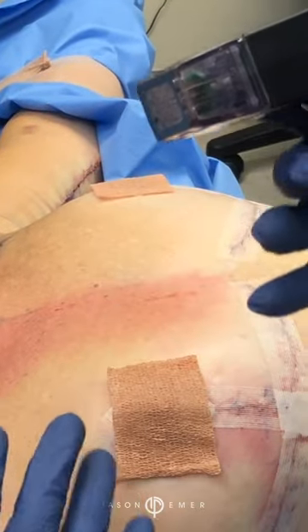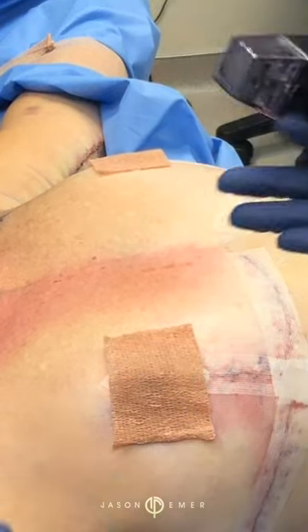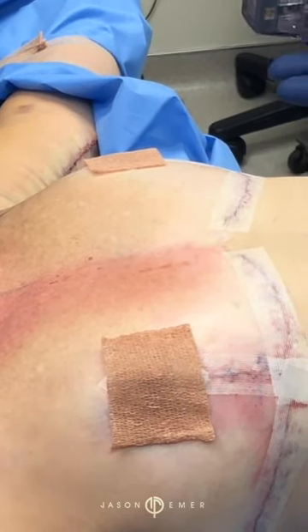The thermal energy is reaching down 5 millimeters, so she's getting a lot of tightening from the deepest level of the skin, where the collagen matrix is, all the way up to the more superficial.